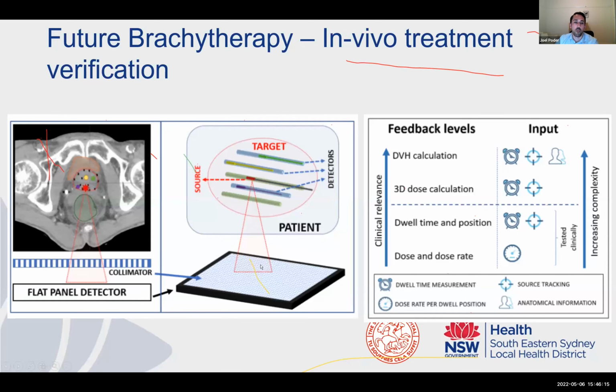And what you can do is use the difference in the dose detected by each of the dosimeters in the array, and you can use this as input into a source tracking algorithm. And what you're able to do is actually reconstruct the position of this source in 3-dimensional space. So a number of these systems are now in use in the research space around the world. And this review article actually provided some recommendations on how things could be rolled out clinically.